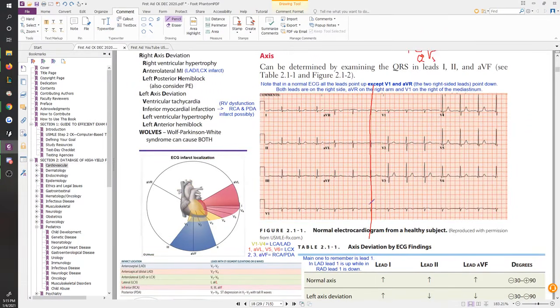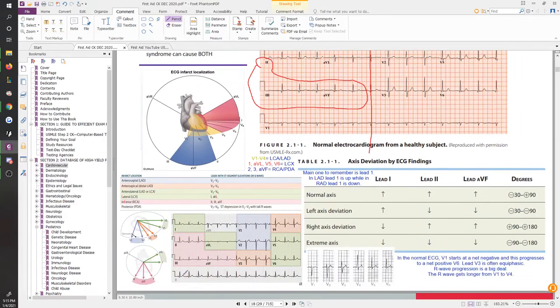Other than that, the other thing you want to quickly always look at is your 2, 3, and aVF, right? So you have your 2, 3, and aVF, this area right here. Okay, in First Aid for Step 1, they have this image to help you start seeing that as well, highlighted in pink, which looks at this bottom area. Right, so in First Aid Step 1, they have actually now kind of sort of started mentioning the axes and things. They don't really talk about it too much, but they have these images that are actually showing you axes, right?